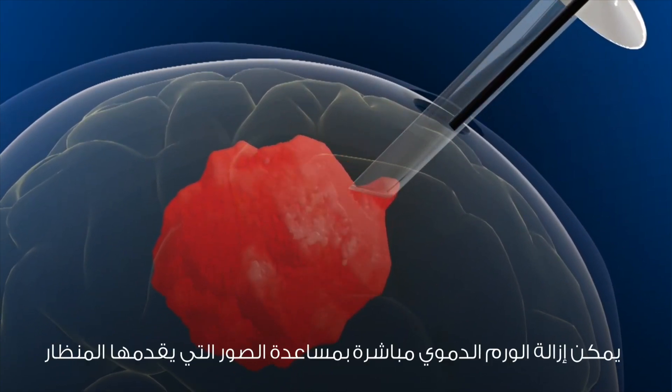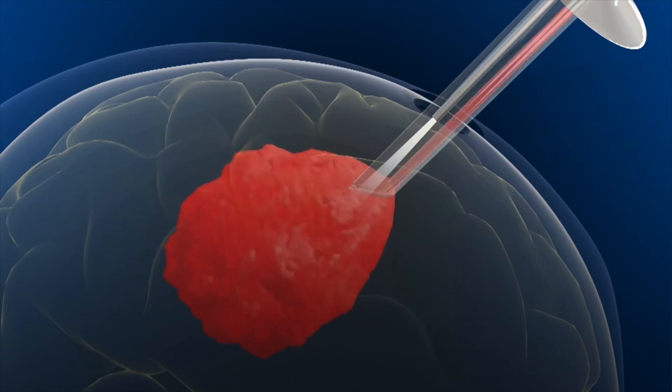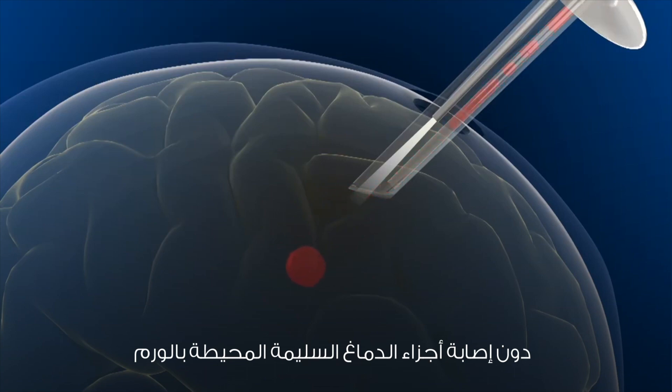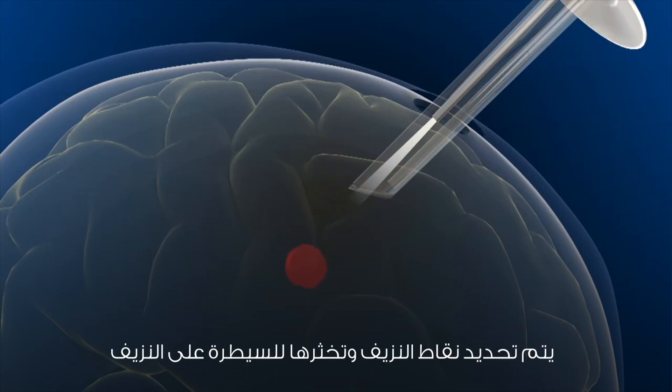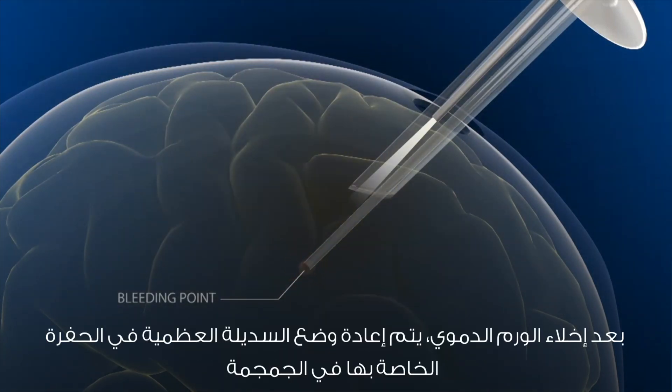The hematoma can be directly visualized by the endoscope with excellent illumination. The hematoma is evacuated using specially designed suctions through the cylinder without injury to surrounding normal brain. Bleeding points are identified and coagulated to control bleeding after hematoma evacuation.